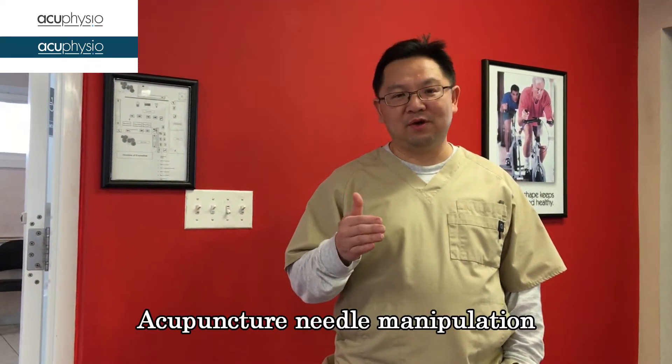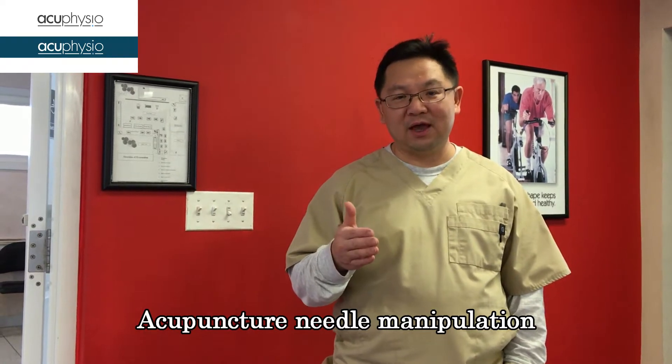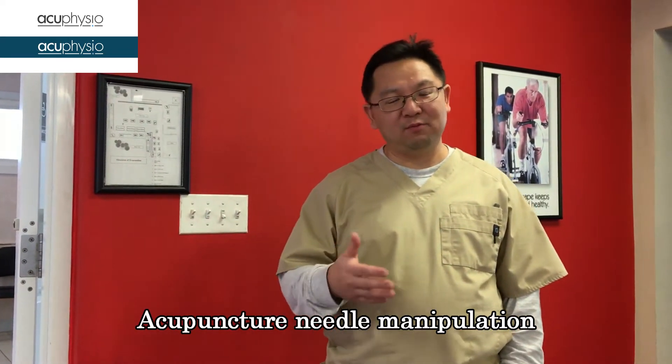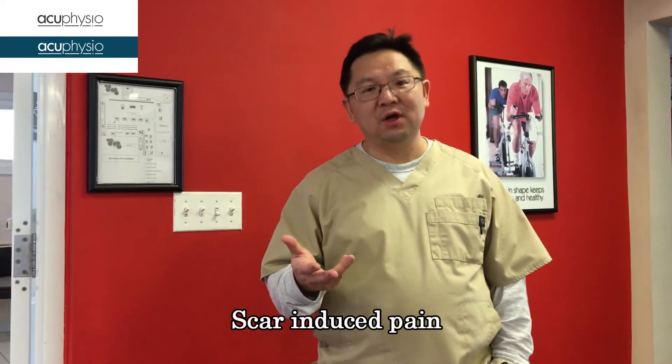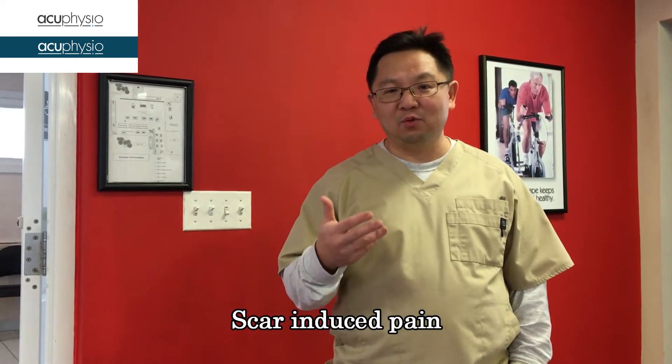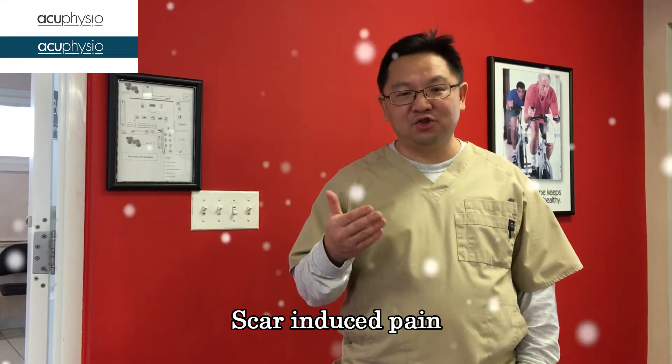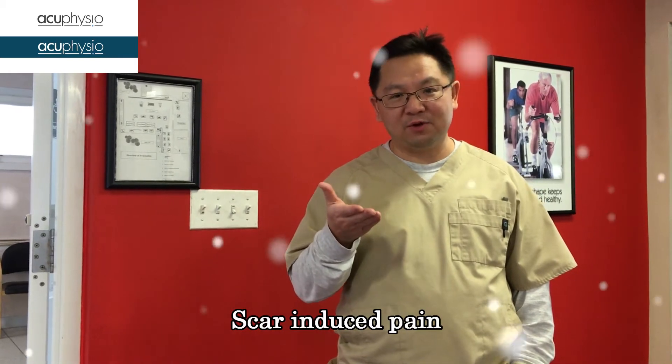Today I'm going to show you how to do acupuncture needling in a patient who had surgery done on the ankle. Usually people with surgery will have some scar formation and pain that is not resolved even with therapy. Doing acupuncture needling can resolve this kind of persisting pain, which is due to adhesion formation. We can use acupuncture to deactivate the trigger point, and I'm going to show you how to do it.